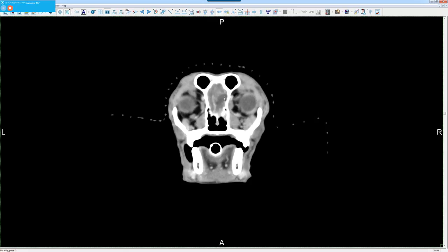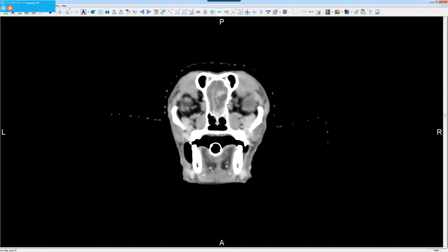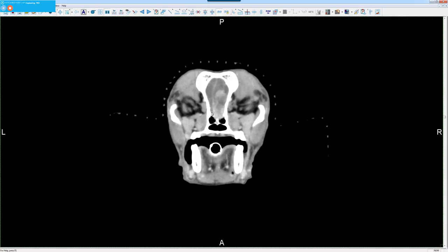This is a tumor type called a cystic meningioma, so fairly common tumor for us to see. And it's in a part of the brain called the olfactory lobe, which we also call the silent area because many times dogs with tumors in that portion of the brain don't have any clinical signs at all other than those late onset seizures. And as we move further back, we can see that the tumor is still quite well defined and fairly large.